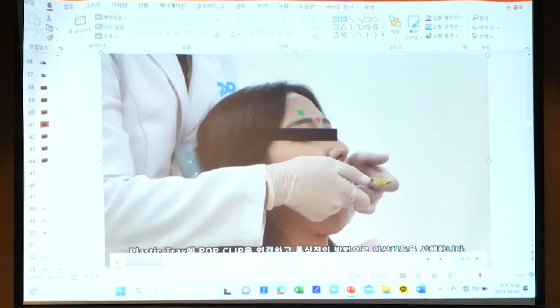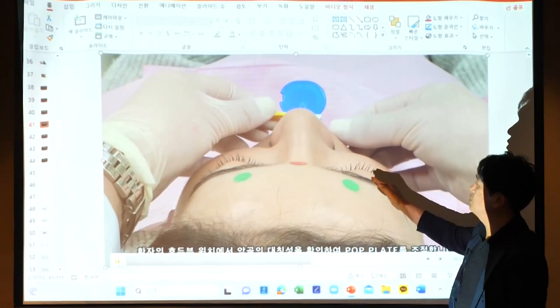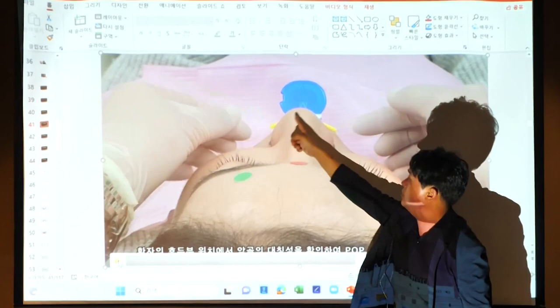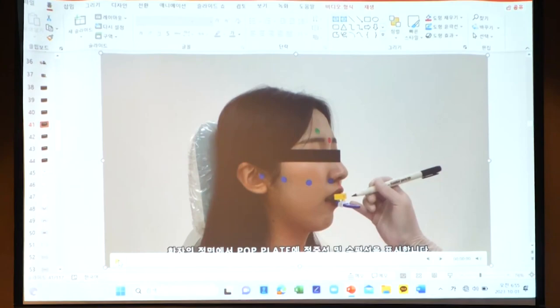When you use the dedicated tray, you can use the pop plate. This is to indicate the anterior occlusal plane. So when the patient has missing anterior teeth, you can use this plate simply. But this is an essential procedure: adjusting the left and right side balance with this plate curvature is very important. And then you have to mark the middle line in this plate. So after removing this tray, pour the gypsum following this line, okay?